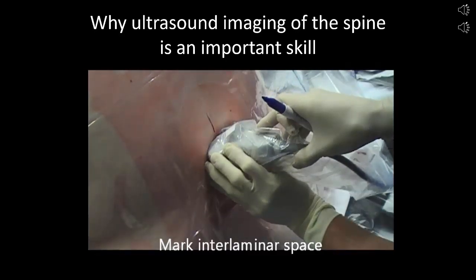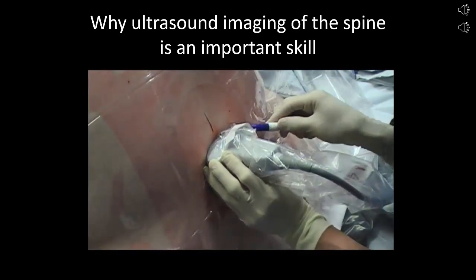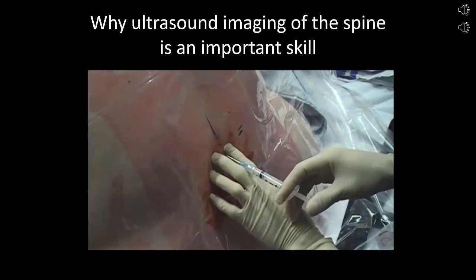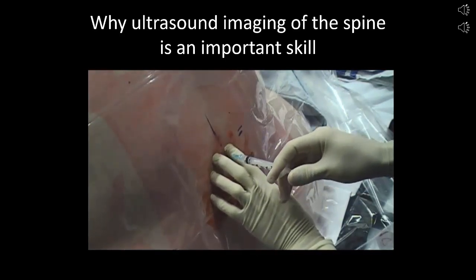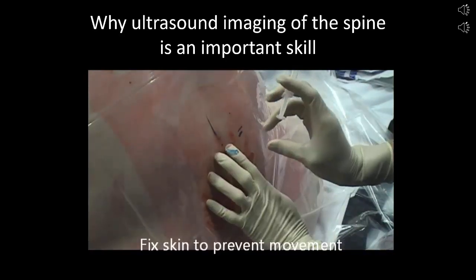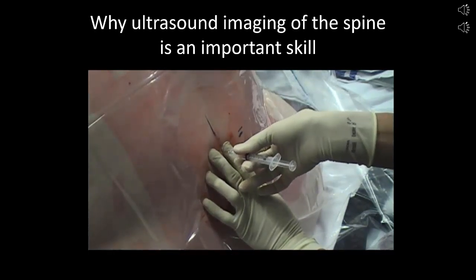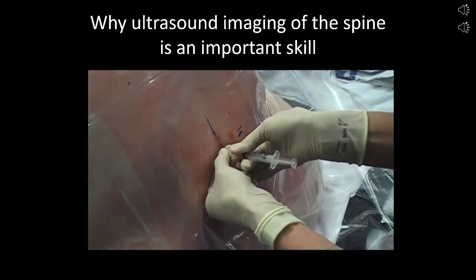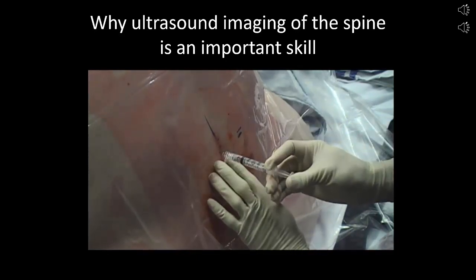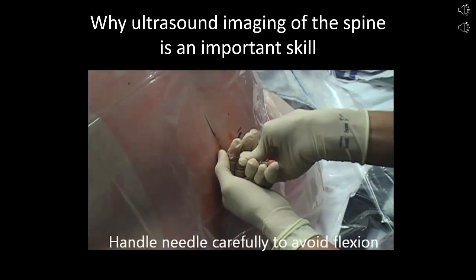You will see that I take pains to be very precise and actually adjust my transverse marking based on identification of the most optimal image. I fix the skin, as always, to prevent any movement. I manage to contact the tip of the spinous process with the introducer needle. Cranial angulation is then adjusted slightly to walk up over the spinous process, and resistance to injection is obtained, confirming that the needle is in the midline. The rest of the procedure is now a formality.